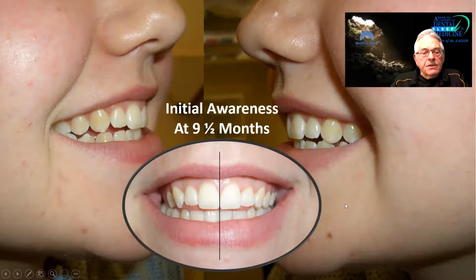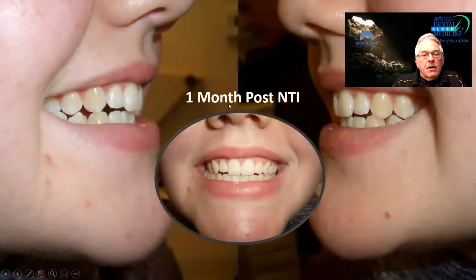So I take the appliance away this day. Here we are now a month later. Midlines are not lined up so much. Teeth are starting to touch a little back here. We have a little bit of incisor overlap. Okay, cuspids are starting to come into contact here. Still missing this a little bit. I'm not saying the occlusion is great. Okay, but the mandible is shifting this direction.